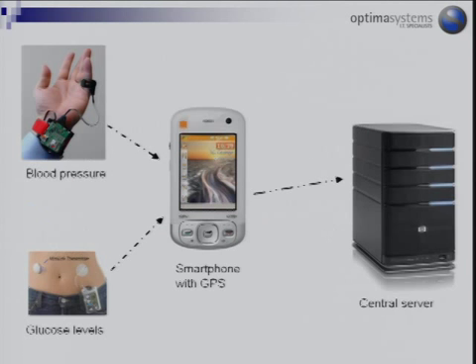And it's not a new idea, I guess, but it's been an interesting project to work on, especially with APL. I've got a couple of pictures showing how this is supposed to work. So you've got the Bluetooth connection from the sensors and the GPRS or Wi-Fi connection to the server. I brought in a couple of examples of sensors. So you see they look a little bit massive there, but they're all in development stages.